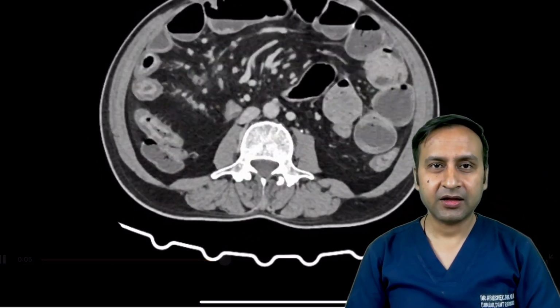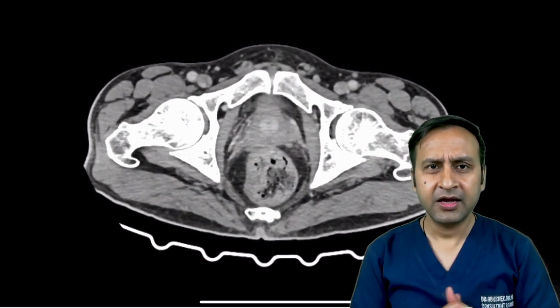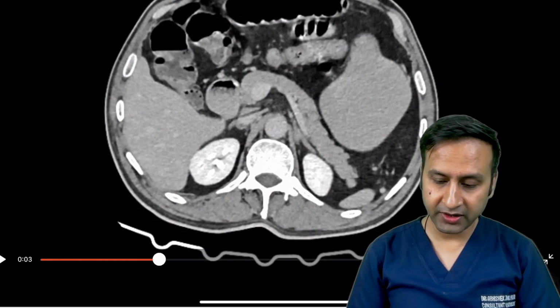What you can see, I think all of you would be able to see that there is something gone wrong with the bowel, the most apparent thing. But there are so many things that are hidden in this video. So let's try to decipher all of them one by one. So now I'm playing the video again from top to bottom.